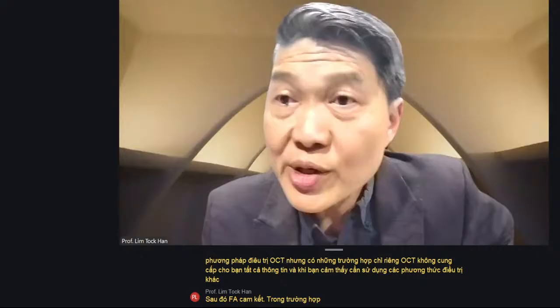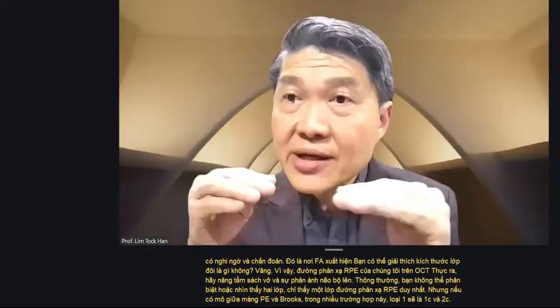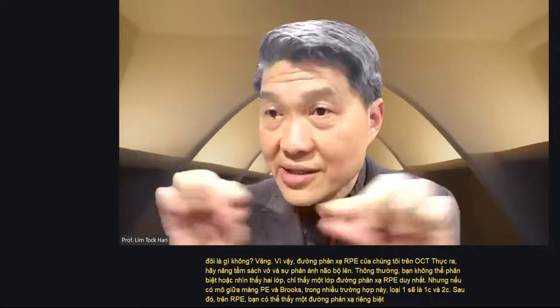Could you please explain what the double layer sign is? Yes. The RPE reflection line on the OCT is actually on top of the Bruch's membrane reflection line, so usually you can't differentiate two layers; you see a single layer of RPE reflection line. But if there is tissue between the RPE and Bruch's membrane, in many cases type 1 CNV, then you can see a distinct RPE reflection line, then a gap, and then the Bruch's membrane reflection line. That's what we call the double layer sign.